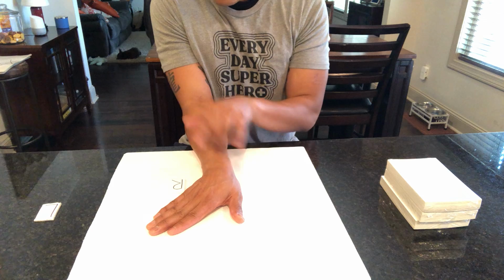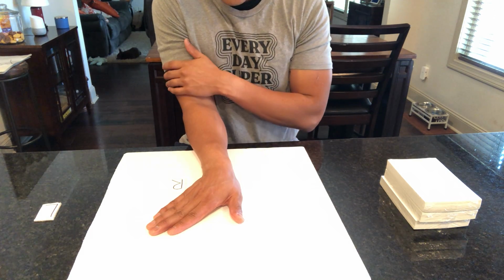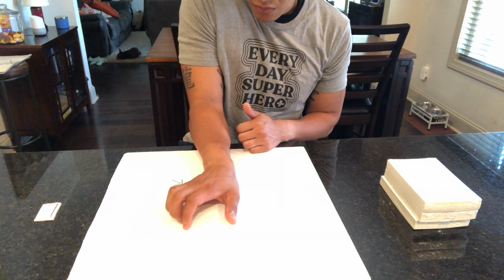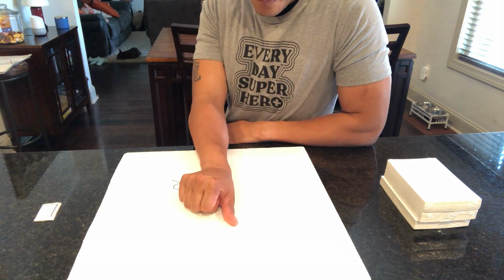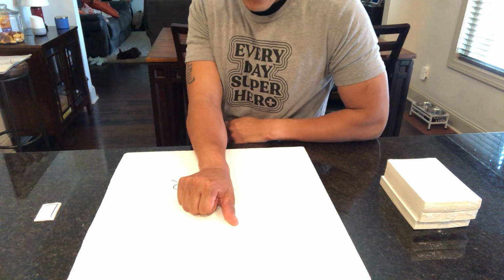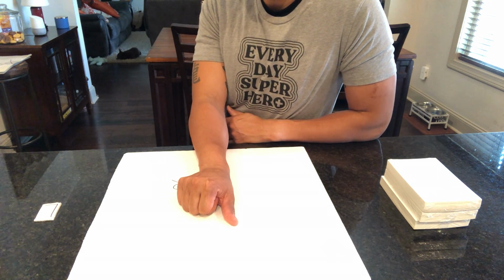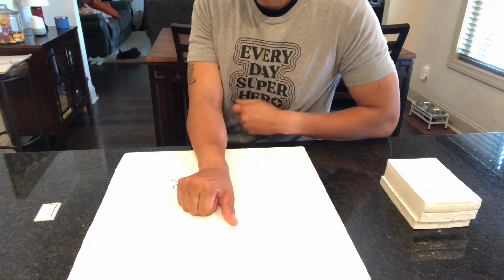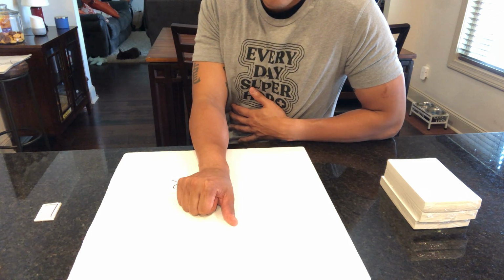Again, collimation, isolating the thumb here, and just your oblique projection. Now for lateral, we're going to have the patient roll the fingers into a fist, which will laterally roll the thumb. And again, central ray is perpendicular to the first MCP joint, and you're getting your lateral thumb projection.